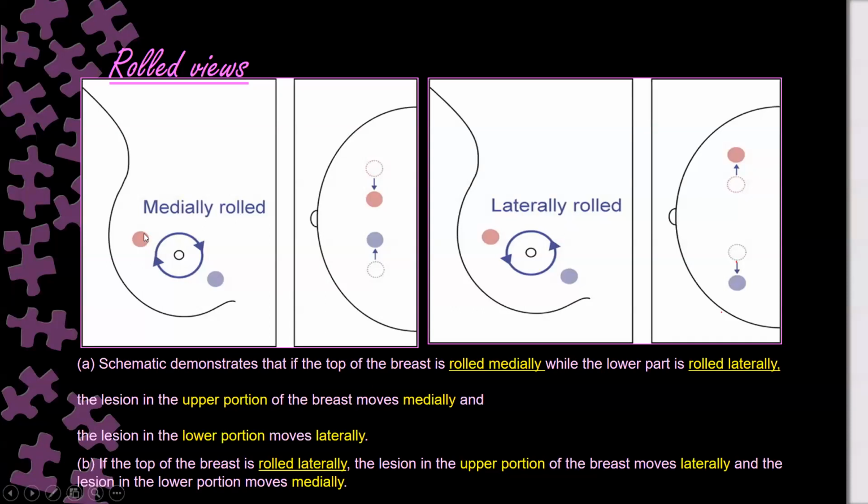medially. If I have seen a lesion here laterally, in the superior portion, and I push medially, then this lesion will go toward medial, and this inferior lesion will go lateral.